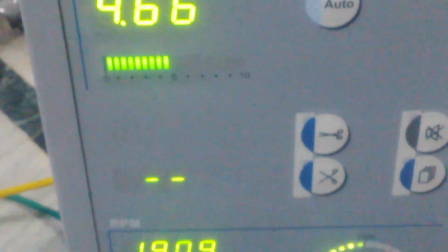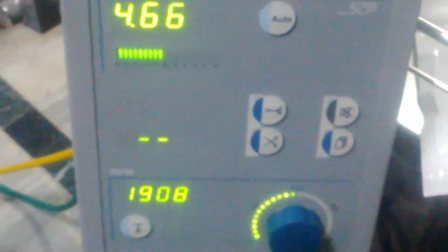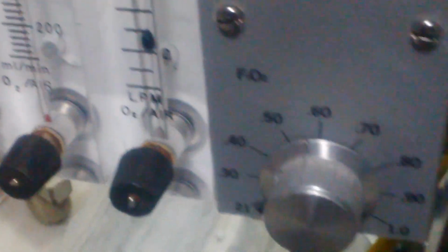Now this is P1, P2, P3. You can have a separate monitor and monitoring system for that, or what we used to do is connect P1 as a separate line. Instead of CVP, we connect P1, because there is no point in monitoring CVP when the patient is on ECMO.